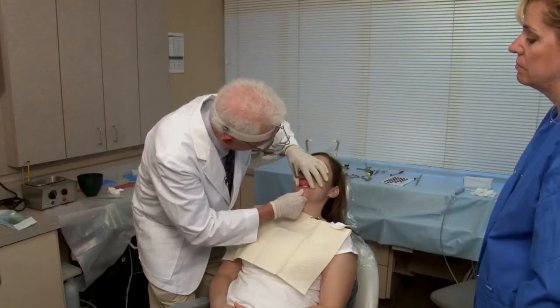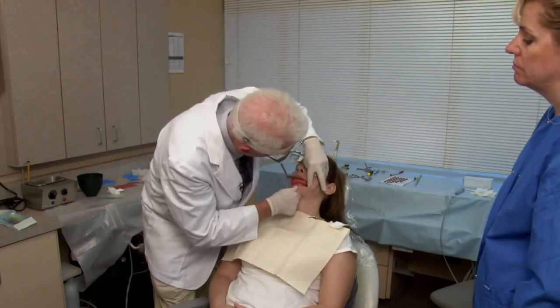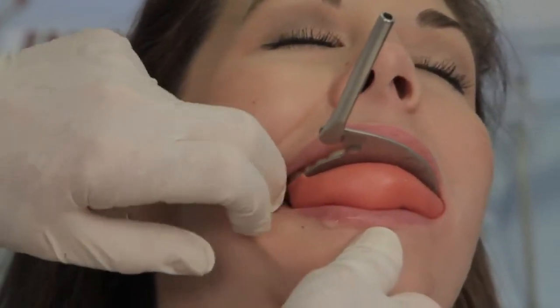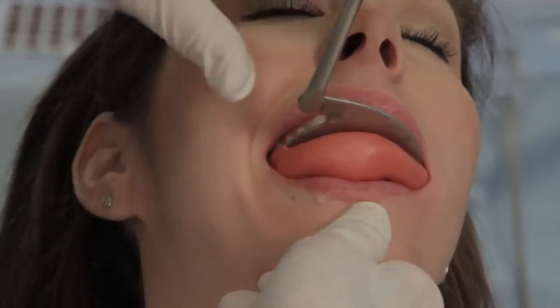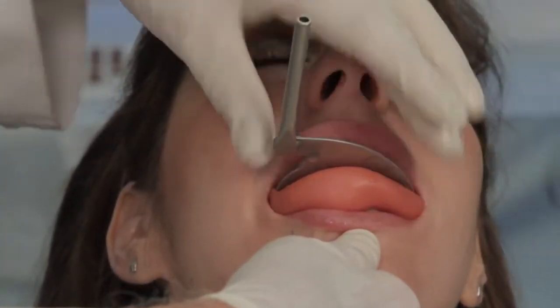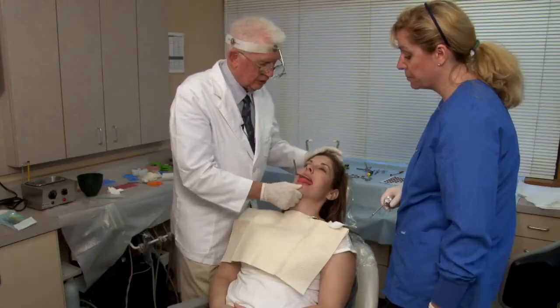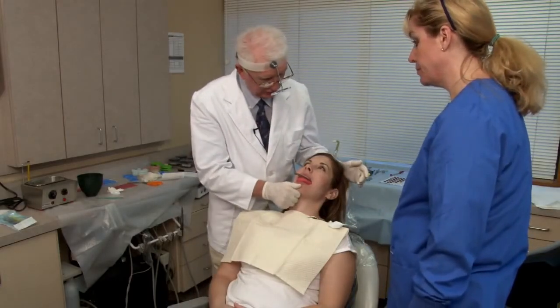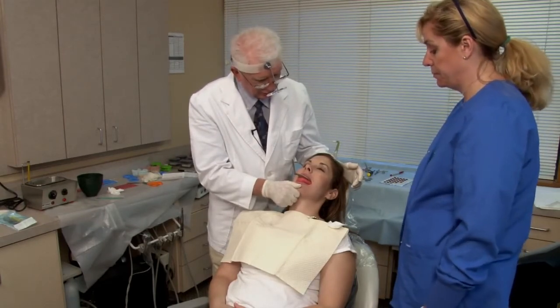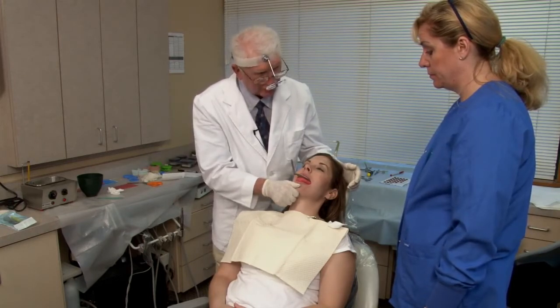Now close slow, close slow, stop. Okay, hold it right there. Now air please, Christy. Allison, stay closed on this. Do not open. Hold it against your upper teeth. Do not let it come off your upper teeth. Stay closed, hold it against your upper teeth.